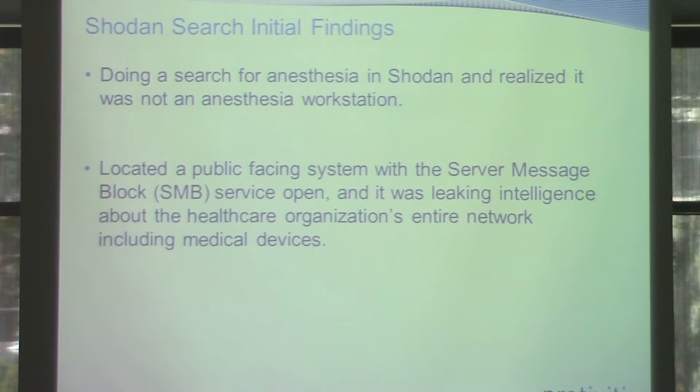But we were doing a search, and like I said, we were looking for medical devices. We weren't necessarily looking for what we stumbled across. I did a search for anesthesia, and I quickly realized that other than it being an XP box, there was no indication that it was really a medical device or a supporting system. When I opened that up, I realized that SMB was open, and it was leaking intelligence on all of their internal network systems, including medical devices.